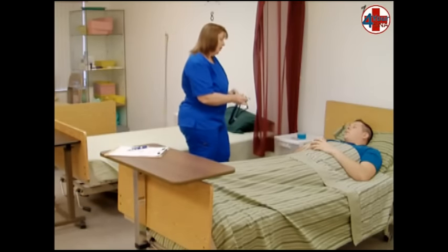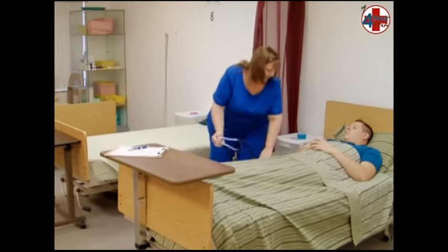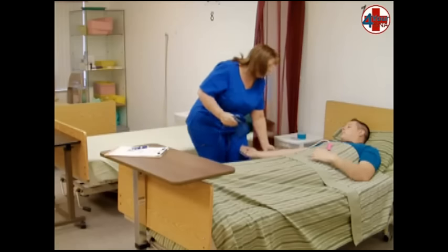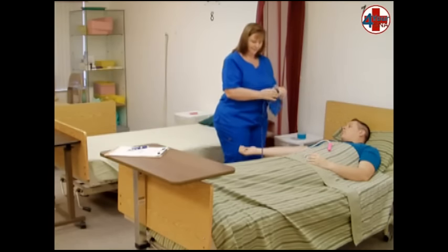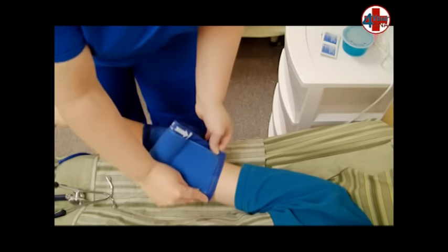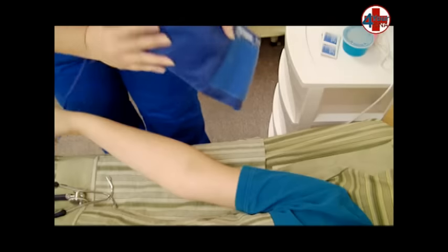Ask the patient which arm he would prefer for blood pressure. Ask him to extend his arm, palm up, and make sure it is supported by the mattress. Measure the cuff by laying the narrow end of the blood pressure cuff over the arm and making sure it covers one-third to one-half of the circumference of the arm.